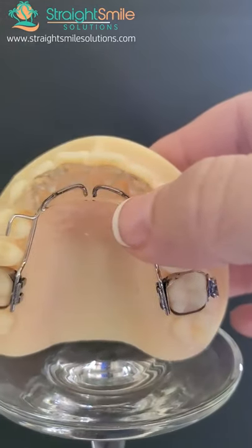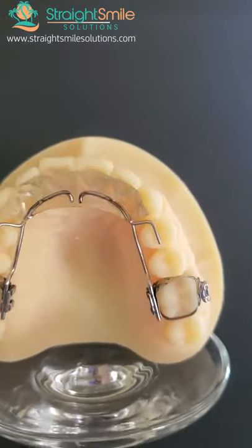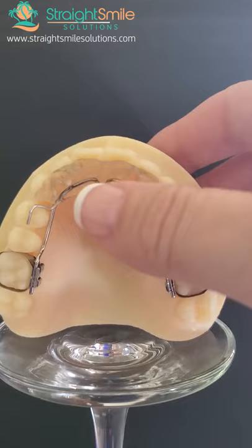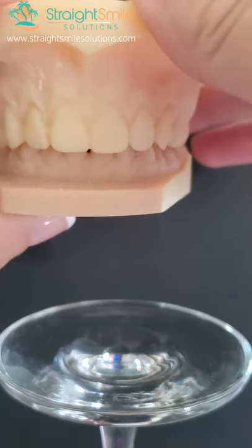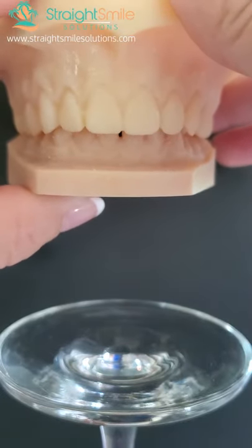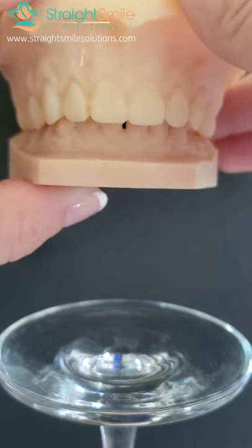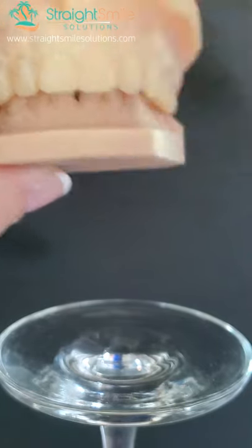This should stay in a good minimum of four months — I would like to see that in, if not longer. Let me show you what it looks like — the difference. Super deep, right? I'd say it's about 60 to 70% deep bite. We see a little bit of the lower incisors, but not all. This is not a good deep bite.